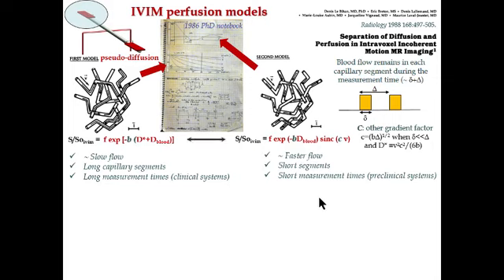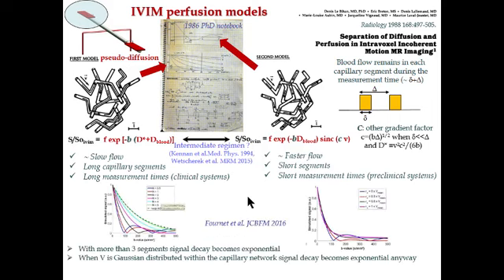So which one shall we use? Well, people have shown that, unfortunately, we could be right in the middle. So it's not really this one, not really this one, we are between the two. Models have been proposed, especially the Cannon model, but in fact, it's quite difficult. Recently, Gabriel Fournet in our laboratory did some simulations showing first that if the blood changes orientation 3 times, it's enough to get an exponential shape.